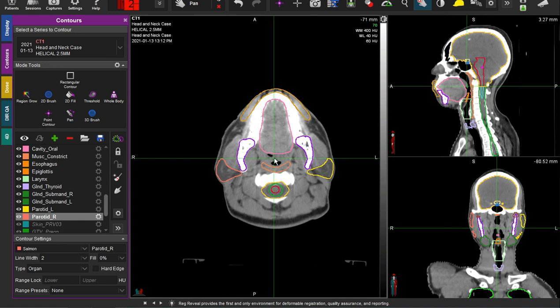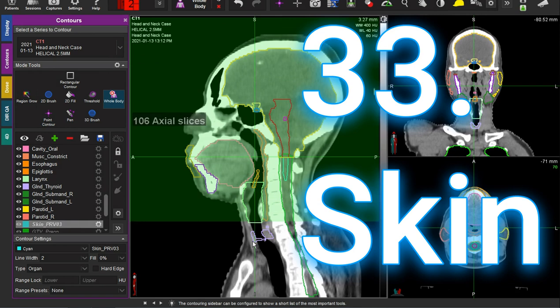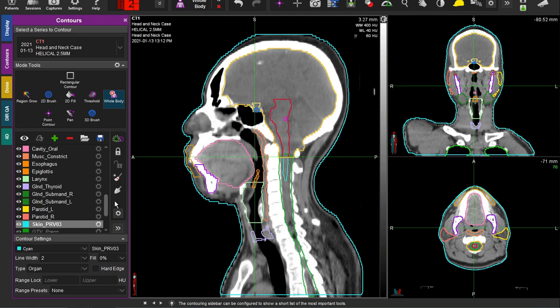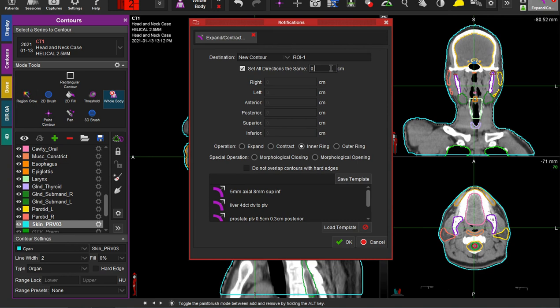And last, kind of like wrapping the present, we are ready to do the skin. Let's celebrate the big old skin contour. This is something called a whole body contour that you can do on your local treatment planning system, and then you just create an inner ring. You can do three millimeters or five millimeters — it kind of depends on the institution. We do three, and there we have the skin.